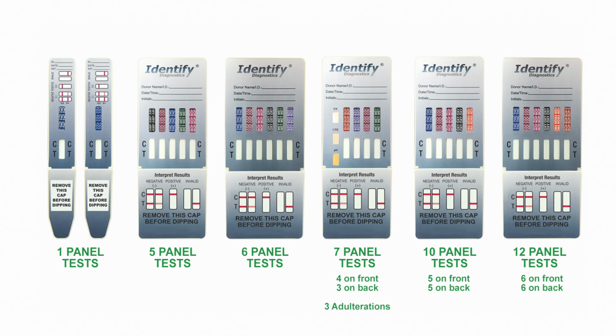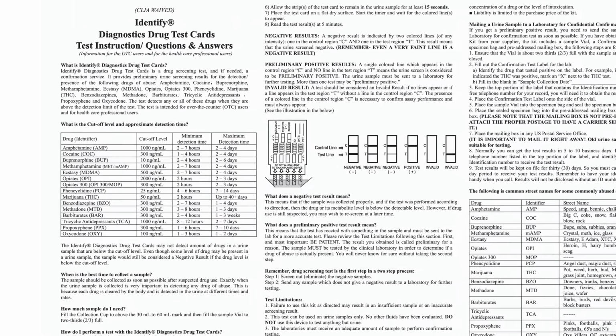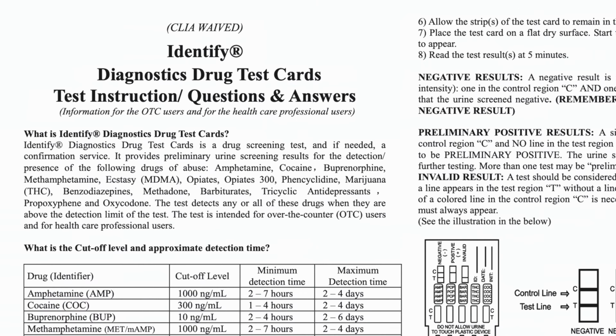Identify Diagnostics offers various configurations. This video is for informational purposes only. Please refer to your package insert for detailed instructions.